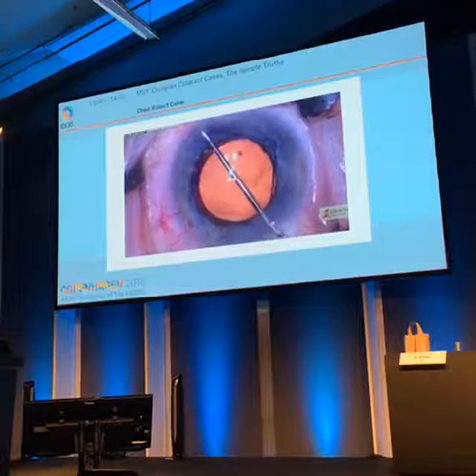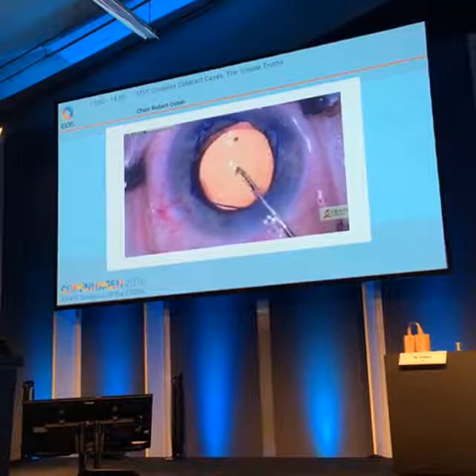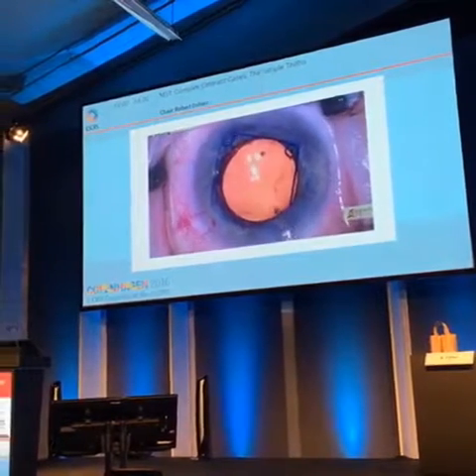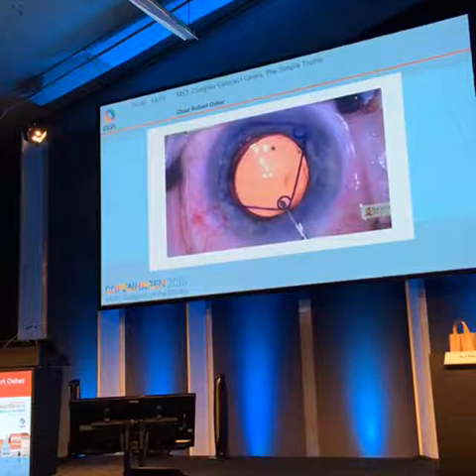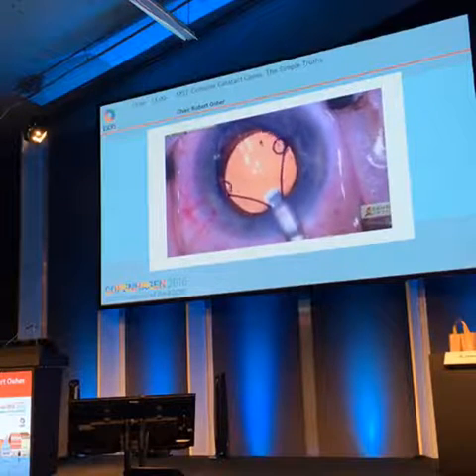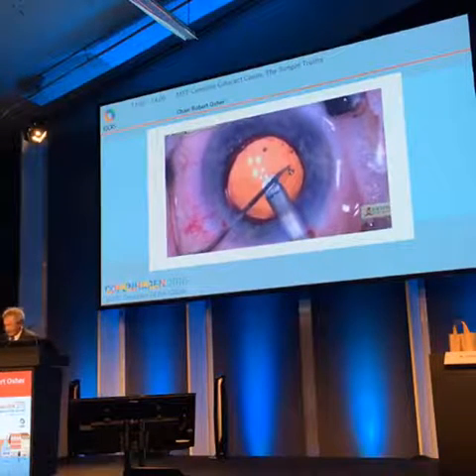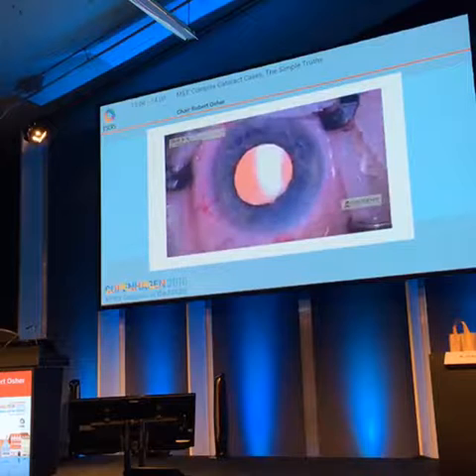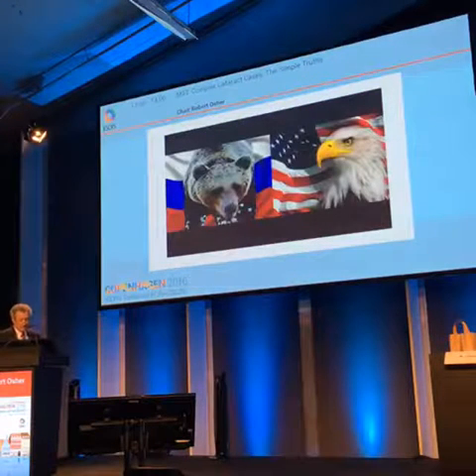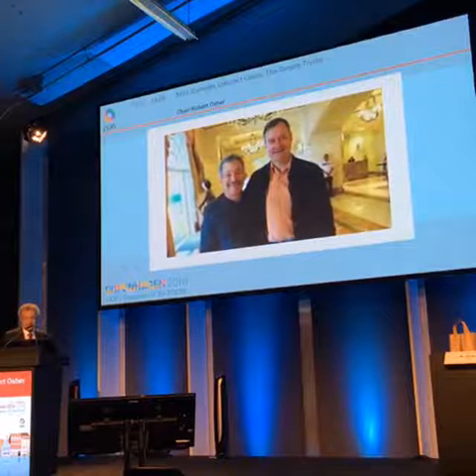For removal, the distal scroll is free. Next, the manipulator frees the lateral scrolls. Lastly, the proximal scroll is free and is best supported on a bed of OVD. The new finger, which now accompanies every ring, has simplified the insertion and removal procedure, which makes surgery better for the patient and surgeon alike. Although their respective countries are sometimes in conflict, the Russian and the American have made a very good team.